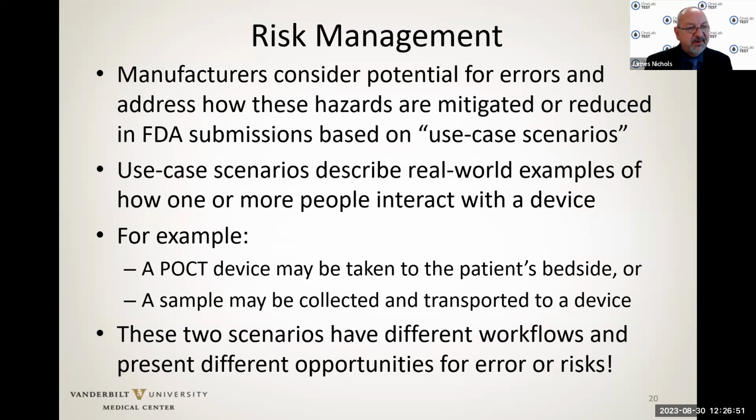This is called a use case scenario for that device. They describe a real world example of how one or more people are going to actually interact with that device. When we talk about, let's take a glucose meter, for instance, we can take that glucose meter to the patient's bedside and do a finger stick and conduct the test at the patient's bedside.